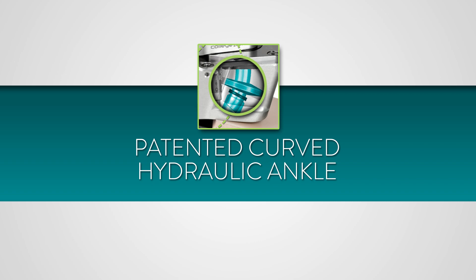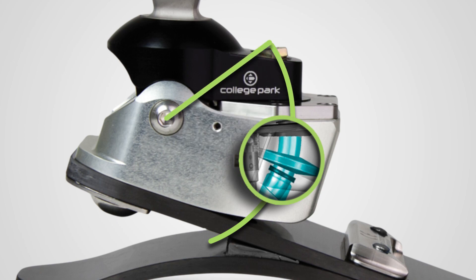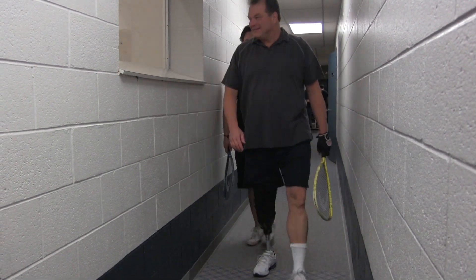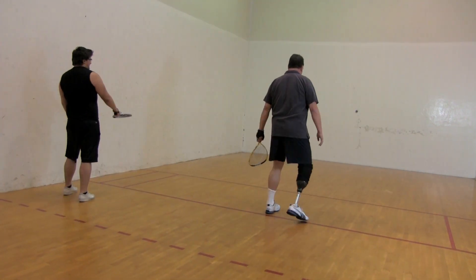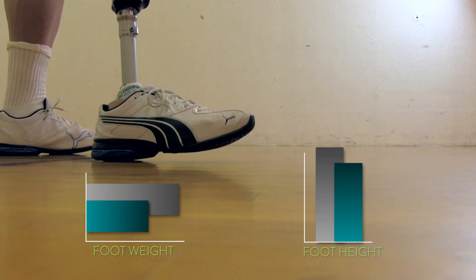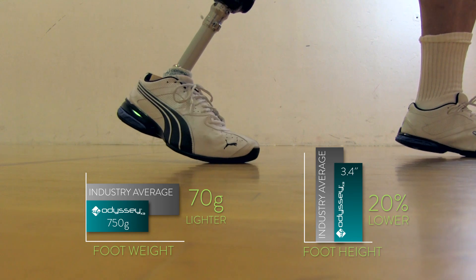The Odyssey K3 uses our patented curved hydraulic system with only one pivot point. This brings a smooth rollover throughout the gait cycle and fewer moving parts for less potential wear and tear. Compared to other hydraulic feet on the market, curved hydraulics also have the benefit of a significantly lighter weight foot with lower clearance.